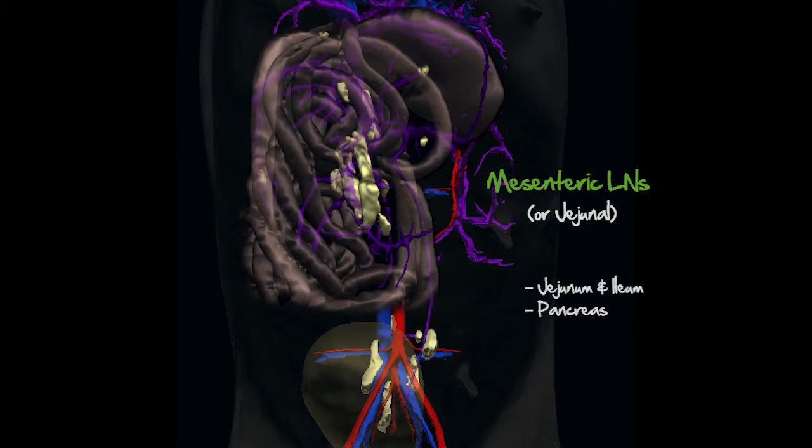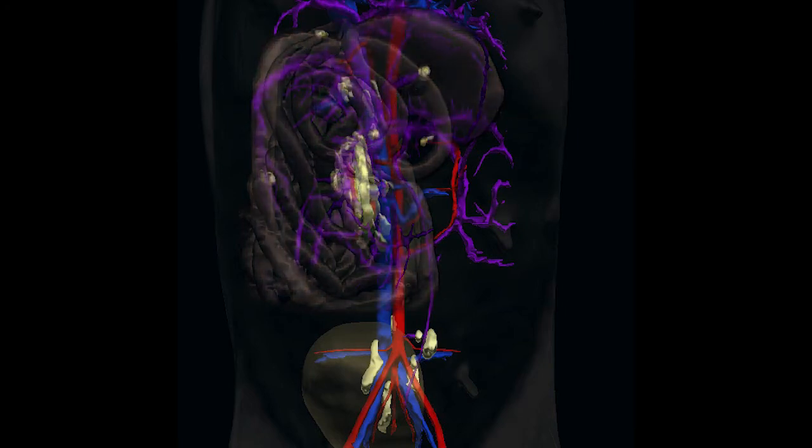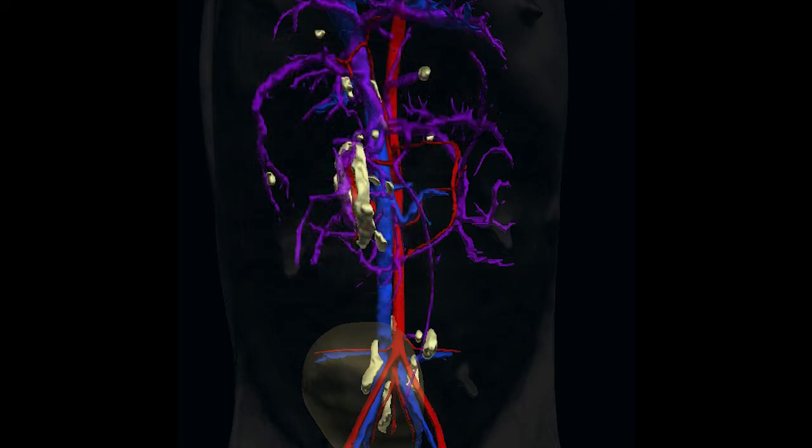Finally, in more isolated locations and in variable numbers, other lymph node groups can be identified: the colic nodes along the descending colon, the splenic nodes along the splenic vein in the left lobe of the pancreas, the gastric node, the pancreaticoduodenal node along the cranial duodenal flexure, and a group of hepatic nodes along the portal vein. These nodes are an important part of the ultrasound exam, especially for cancer staging.